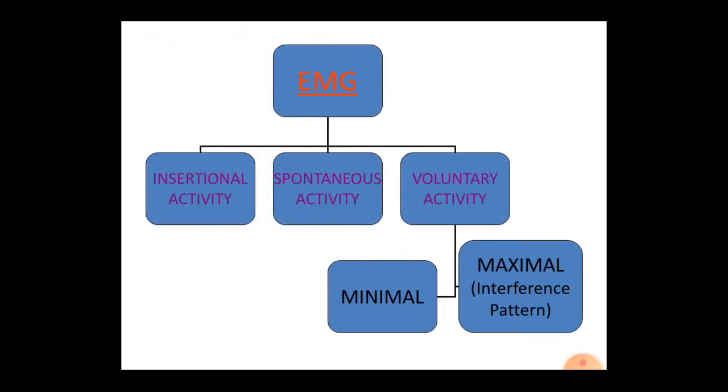Now let us see for EMG. So EMG, that is electromyography, has insertional activity, meaning whenever the needle is getting inserted inside the muscle, whatever activity is seen at that time is known as insertional activity. Another is spontaneous activity. So the needle is already inside, the therapist or examiner is not moving the needle, and the patient is not contracting the muscle, so it is known as spontaneous activity.